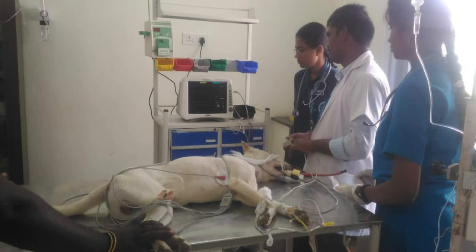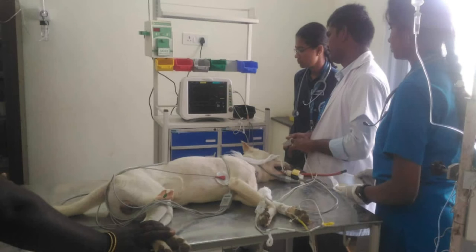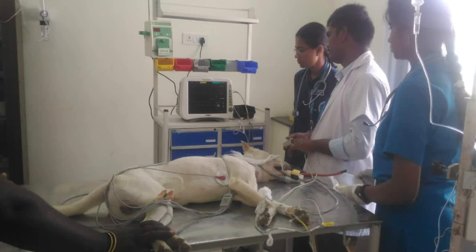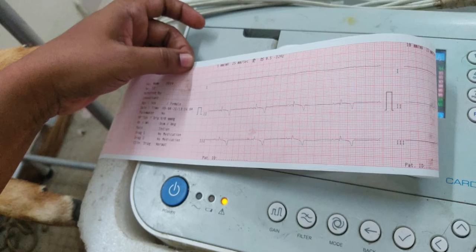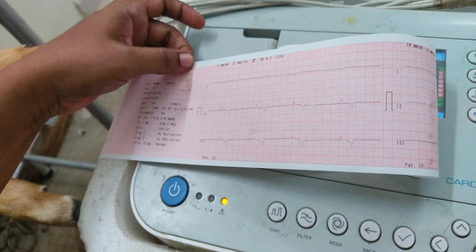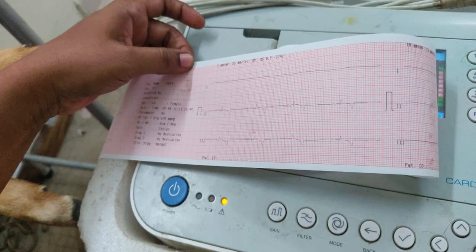Electrodes should be attached to the elbows and stifles. Limbs should be held parallel to the floor and perpendicular to the long axis of the patient. For hairy breeds, the area must be clipped before adhesive patches or alligator clips are attached.